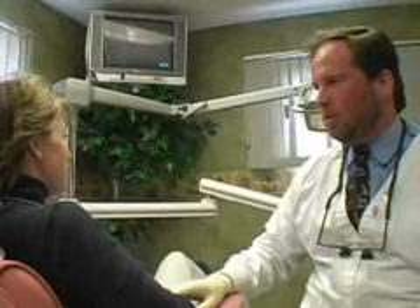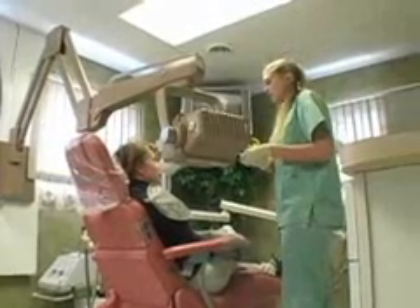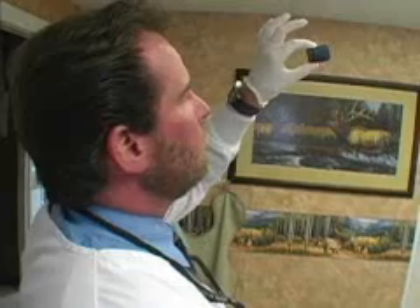You just had root canal — it wasn't too bad, was it? Did it hurt? 'No, it was easier than some of the fillings that I put in.' We're going to get a quick X-ray. We always want to verify how the root canal looks because you can't really see everything until you're done. Once you take the X-ray, you can see what it looks like underneath, and it looks very good.